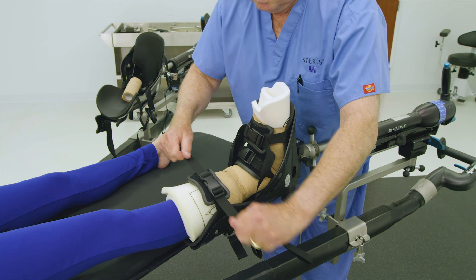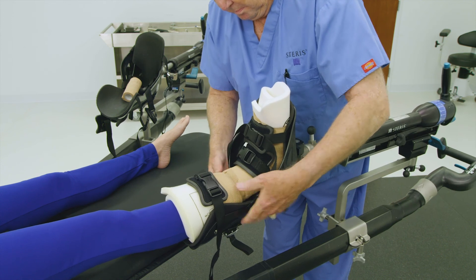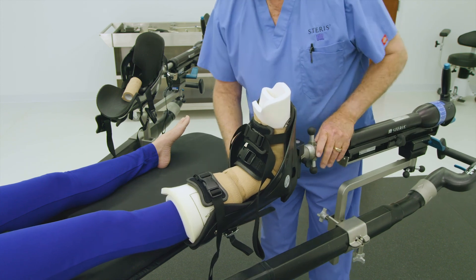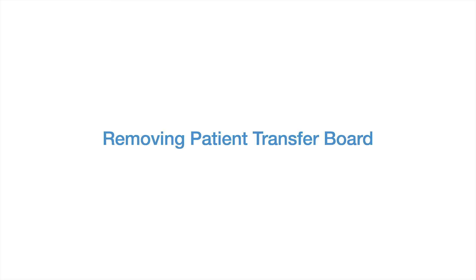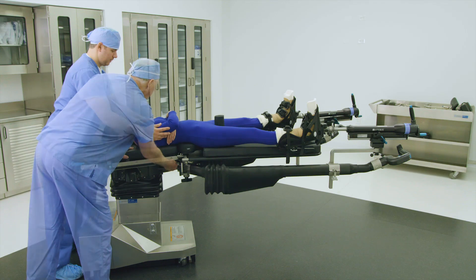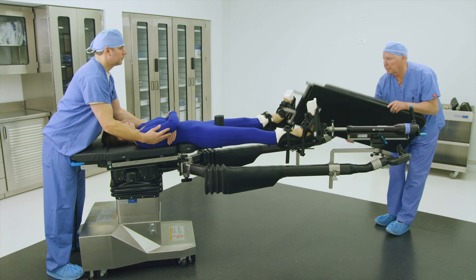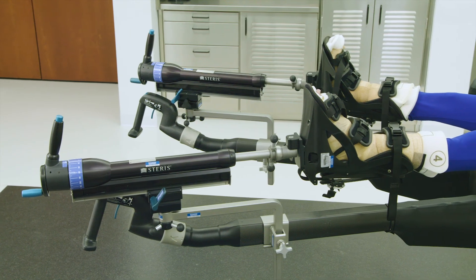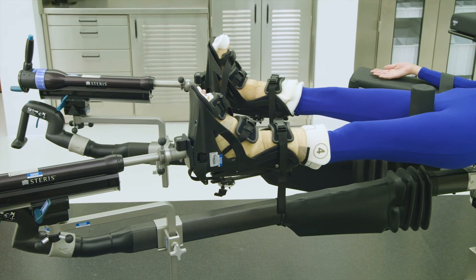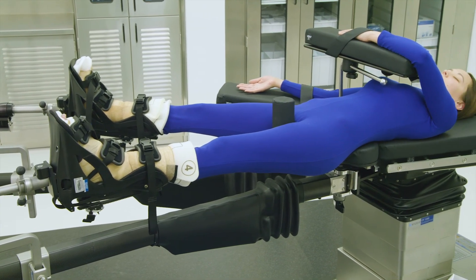Repeat these steps with the other patient's foot as clinically necessary. Some orthopedic procedures may only require one patient's foot in leg and traction. A universal leg holder will be used for the other leg in these unilateral situations. Unlock the two knobs under the left and right side of the patient transfer board's prongs, found right above the abductor spar rosettes as shown here. Remove the patient transfer board and return to storage. When setup is complete, the Steris OT Table should look like this for the intended procedure. Refer to the OT Table Setup Guide, pages 8 through 21, for written instructions on setting up the table for this orthopedic case.